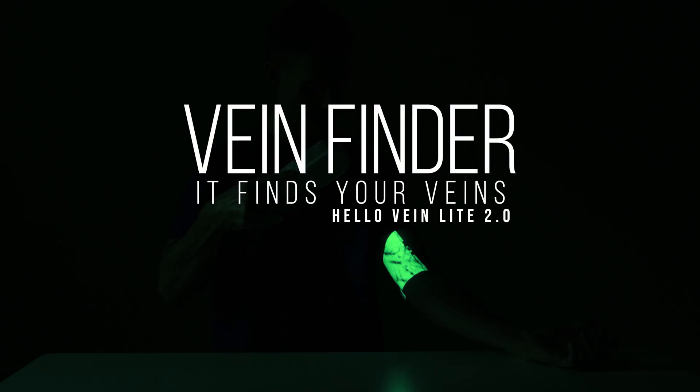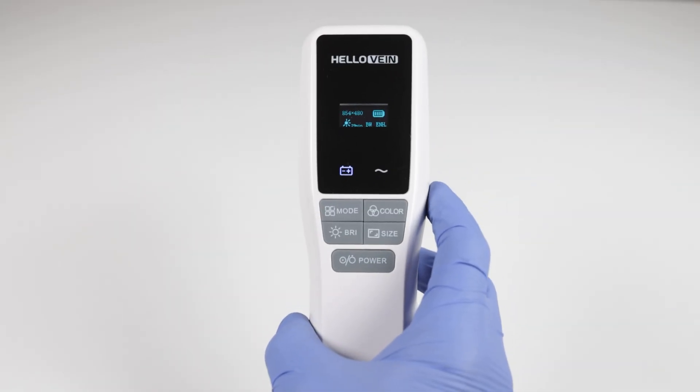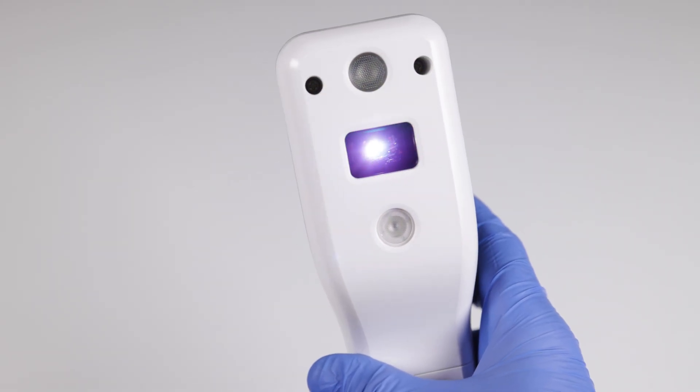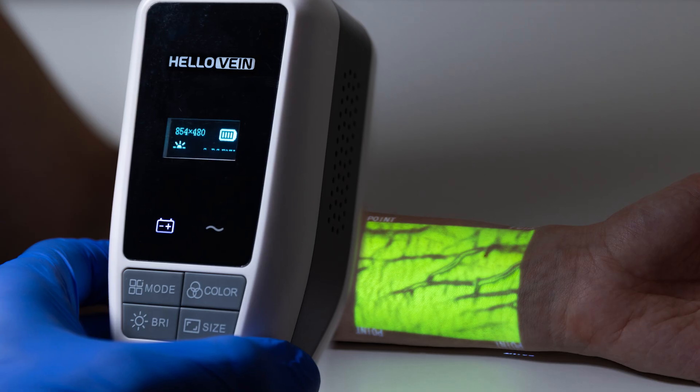This video is going to take a look at the HelloVein 2.0 Light, a medical grade infrared vein finder. Most vein finders use an infrared light that shines out and detects the vein beneath the surface of the skin, then projects an image on top of the arm outlining the vein.